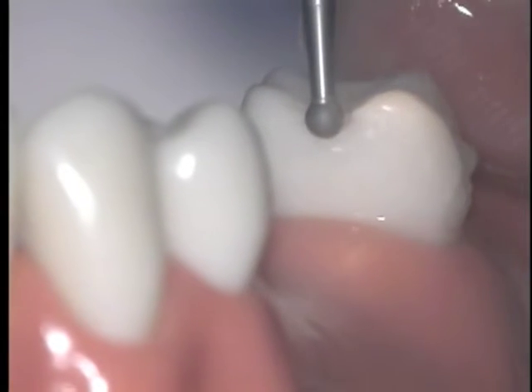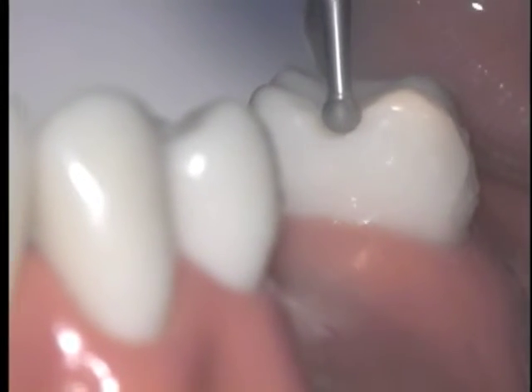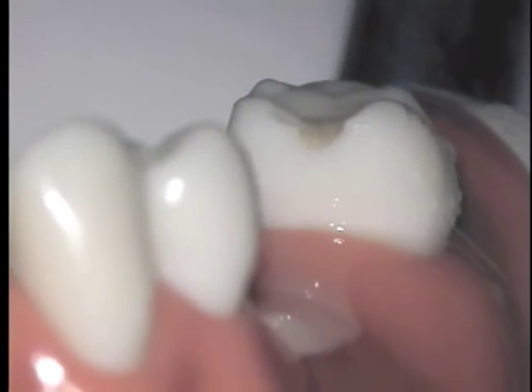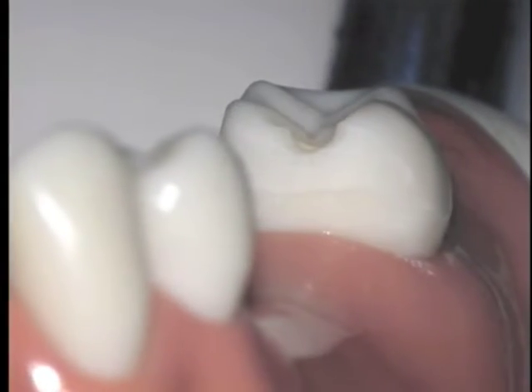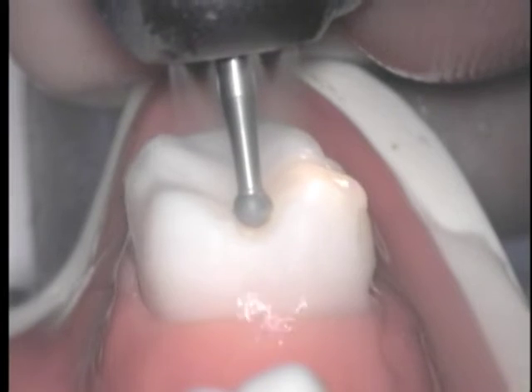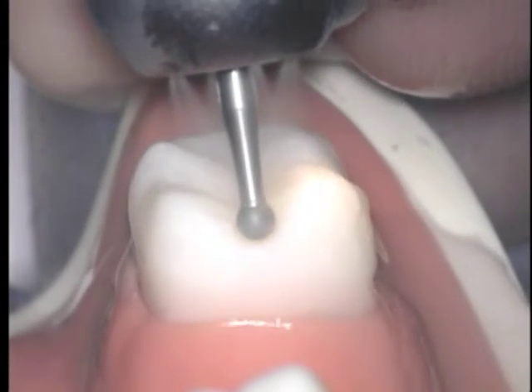Once you've established the initial depth of your preparation, begin to widen the area at the proximal surface to create the wider base of the triangular rest seat. This is necessary for bulk to ensure that the metal rest has sufficient strength to prevent fracture where it joins the minor connector. Continue to widen the base of the rest seat at the marginal ridge until it is approximately one-third of the buccal-lingual width of the tooth, whether that's a molar or a premolar.